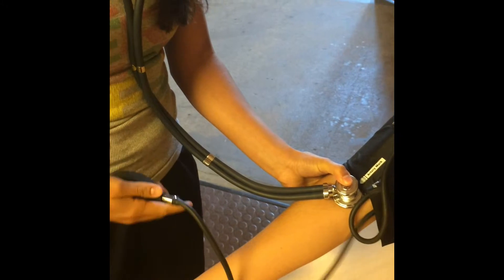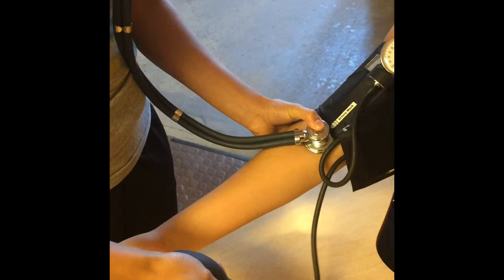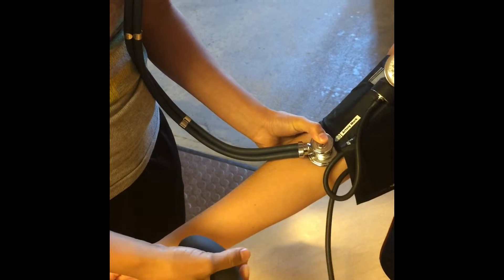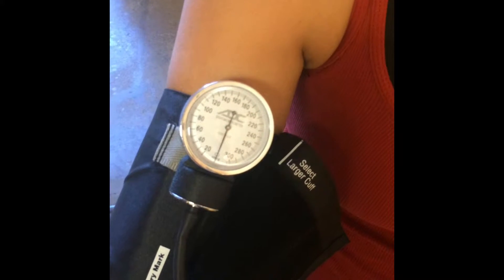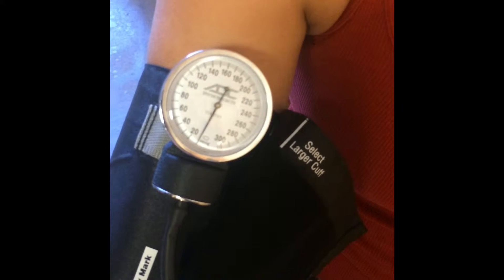In order to increase the pressure in the cuff, you must adjust the valve and make sure it is closed. If not, there will be no pressure put into the cuff. If you have problems putting pressure into the cuff, make sure that the valve is tightly closed and then continue pumping pressure into the pump so that the cuff is inflated.